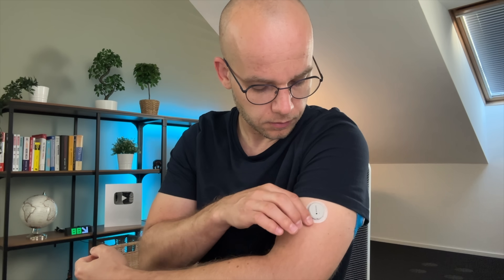Unfortunately there is no clear timeline on this upgrade, so some of you might be already using the new adhesive and some of you might get it in one of your next batches of Dexcom G7. But my guess is that it should not take very long for everyone to get this new adhesive. What do you think of the Dexcom G7 adhesive? Is it good enough? Let me know in the comments down below.